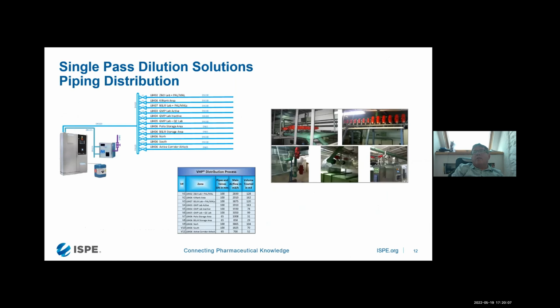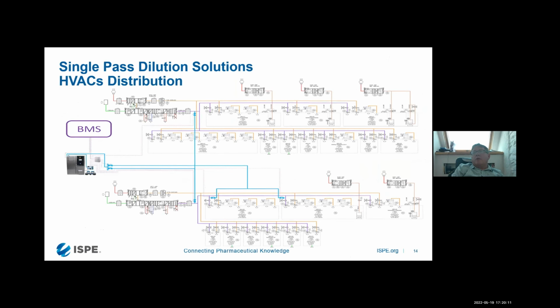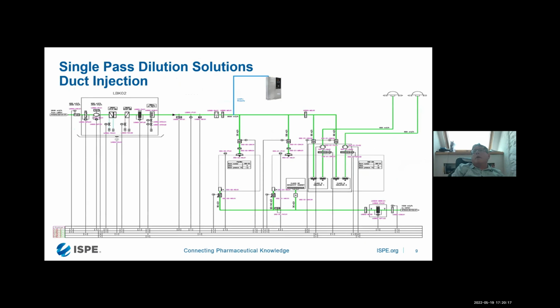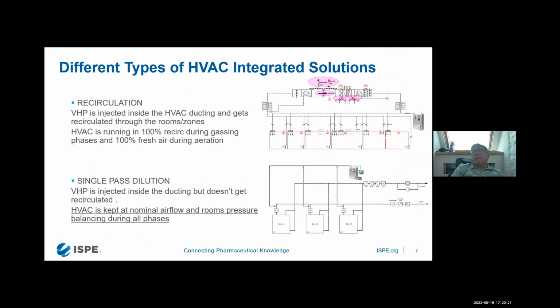And if it's BSL related, let me show this. It's not here, sorry. So this is BSL. We are decontaminating the inlet and also what many people call the police filter, so the outlet.